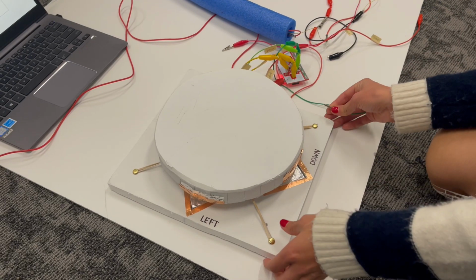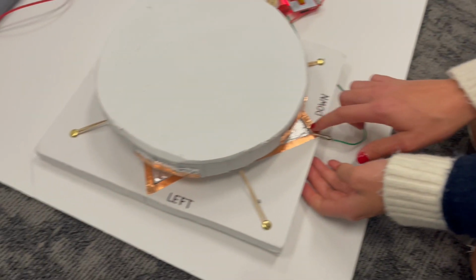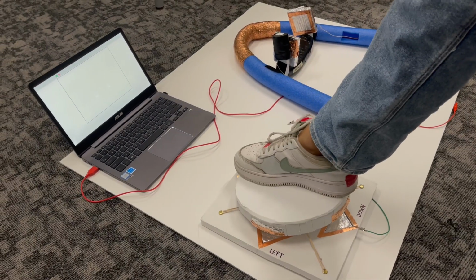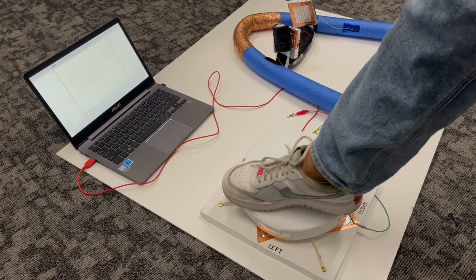So to use the attachment, you're gonna first connect ground to any 4 of the arrow keys, connecting it just to the copper tape on the outside, and then using one foot, you're going to be able to press the up, down, right, and left arrow keys.